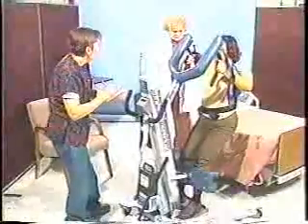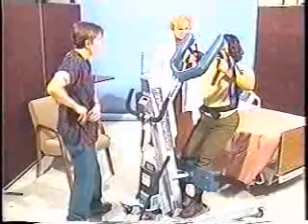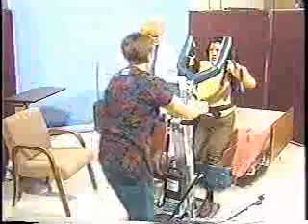Let the weight steady and record the reading. Do not touch the lift or the patient being weighed, as a false reading will be obtained. Return the patient to the bed or to a chair as desired.